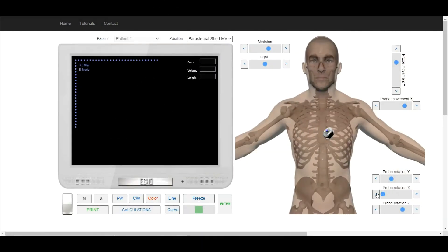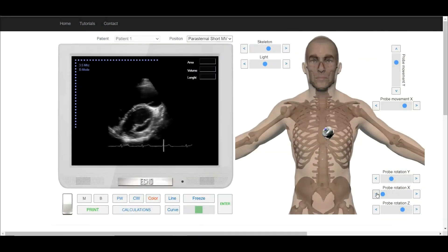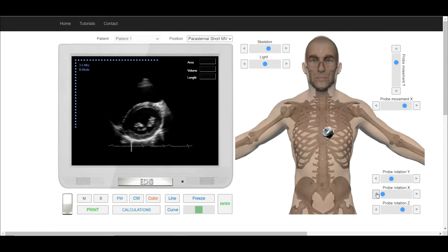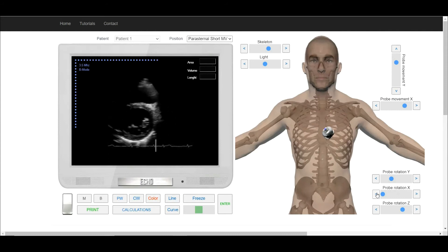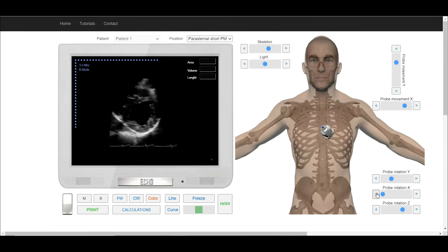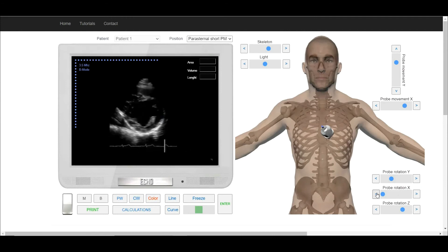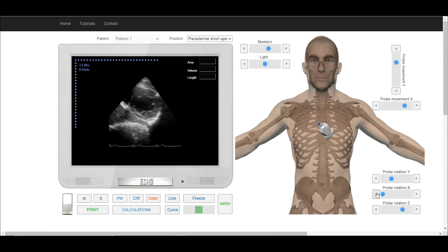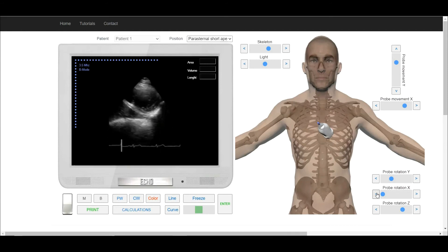Tilt the transducer a little down and we will see the short axis at the level of the mitral valve. Tilt a little more and we will see the short axis at the level of the papillary muscles. Tilt a little more and we will see the short axis at the level of the apex.